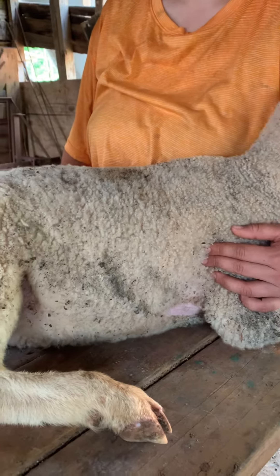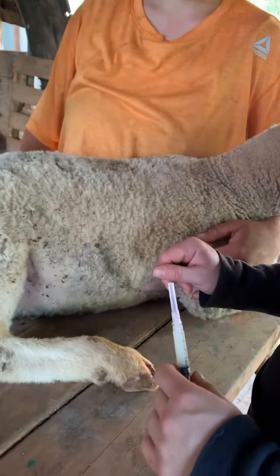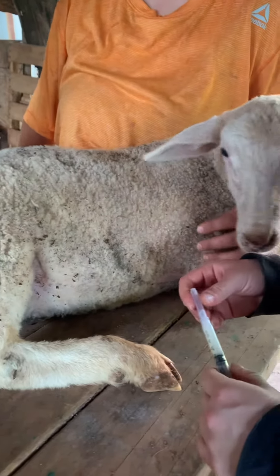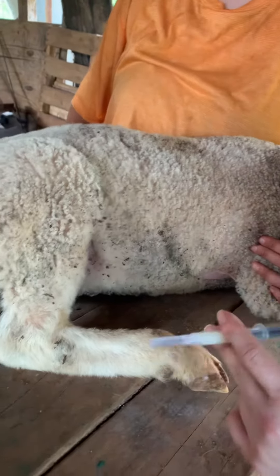It's going to be a little easier for us to do the demo here on his leg, and it doesn't burn anything. Make sure all the air is out. With this particular vaccine, you have to shake it up when it's in the bottle, and sometimes if you take too long it'll settle in the syringe, so you want to shake it up. Make sure it's well mixed in there and the air is out.